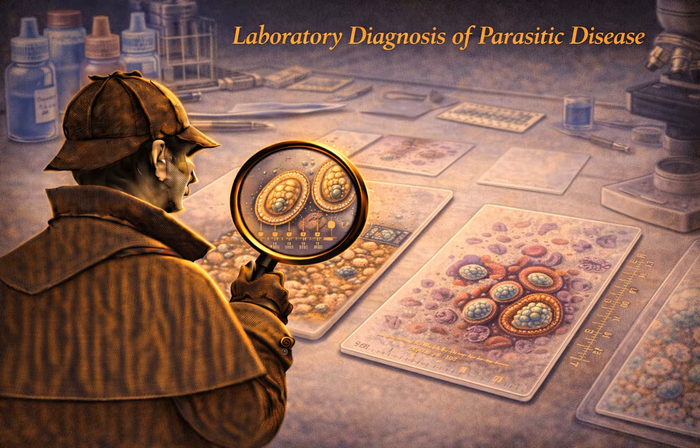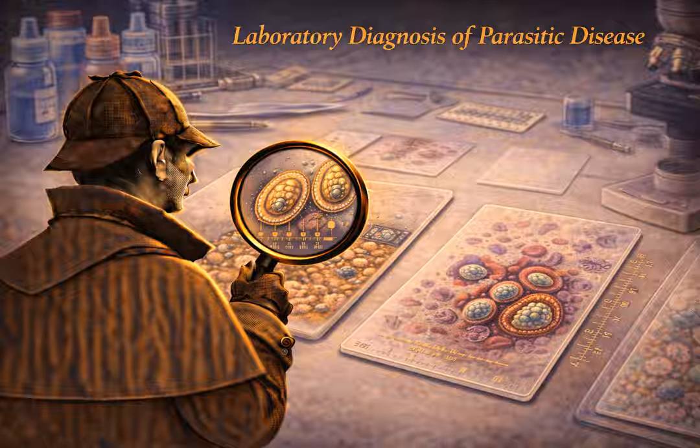Precisely. The thin film is all about specificity. It answers the question, which exact species is killing my patient? For the thin film, the red blood cells are chemically fixed with methanol before the stain is applied, so they remain perfectly intact and hold their shape. You can carefully examine the exact relationship between the intracellular parasite and its host cell.